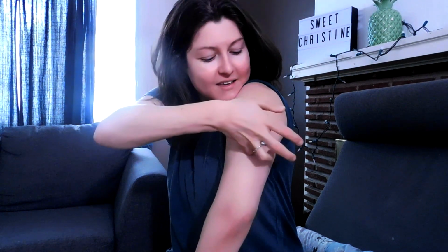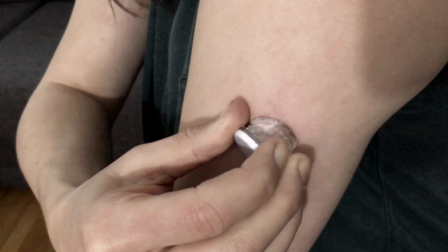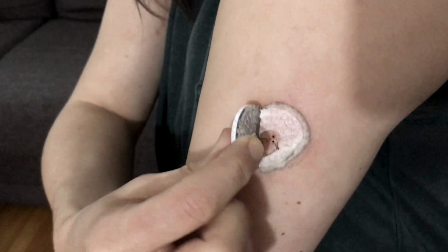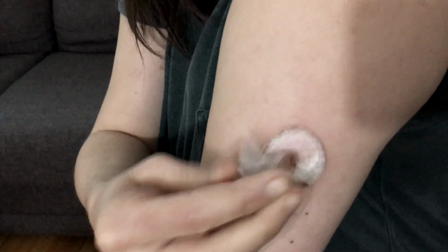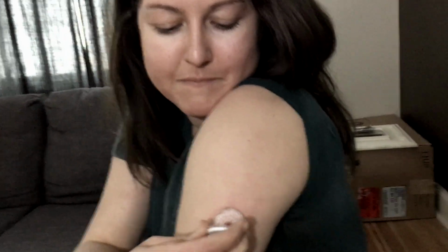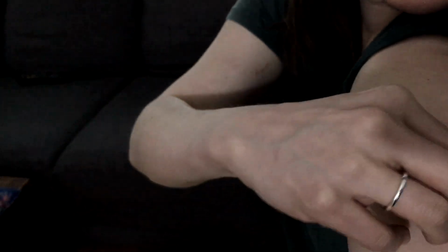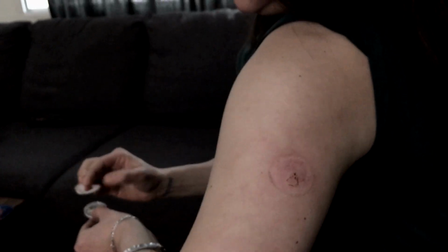It was quite hard, I must say, not because it was painful or because the needle was stuck or anything like that. The glue is extremely sticky, so you remove it by really pulling at it, and then you'll have the little round of gumminess and sticker that's on. I was able to remove it with rubbing alcohol, which was fine. And it did leave a mark. I had sort of a bruise and a bit of rough skin on the area where I'd placed it. It lasted about 3-4 days. It healed properly, so I don't feel nervous to put the sensor back there in 2 weeks.